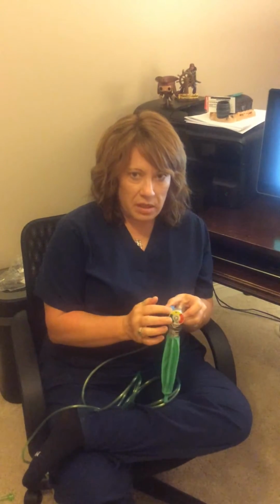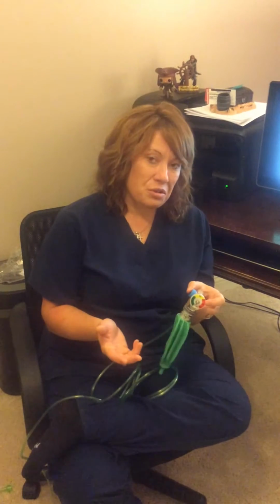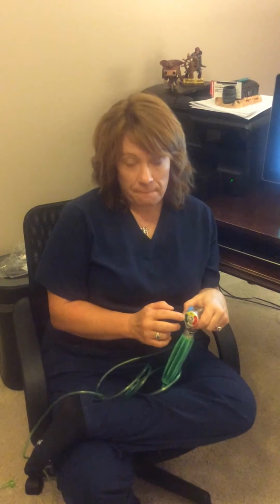You can see here is a manometer, and this gives you a guideline of the pressures you want to go to. What pressure do you want? You want a pressure that's going to inflate the chest. You're going to want to see the chest move. You don't need to see a big, huge chest rise. It's very easy to blow a pneumothorax on these kids. Usually with real premature infants, a PIP, or a pressure, of 20 would be sufficient.